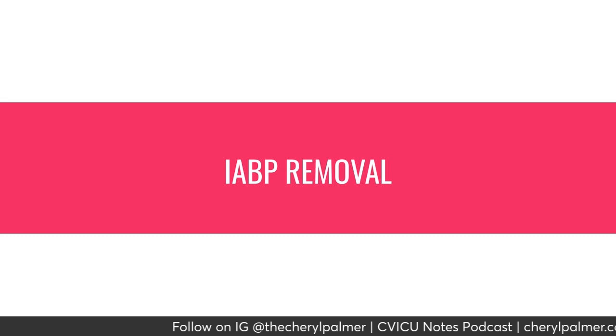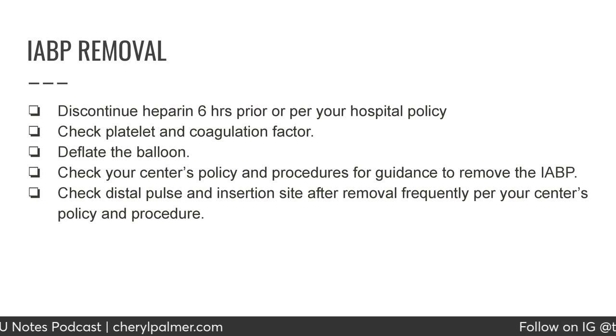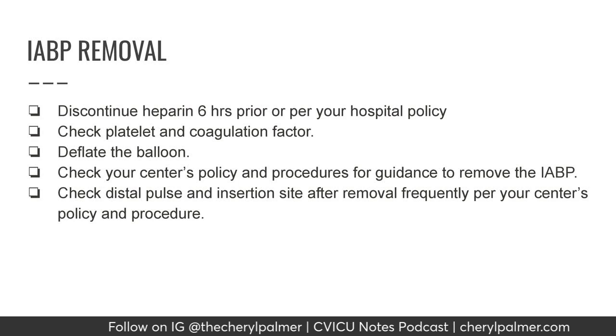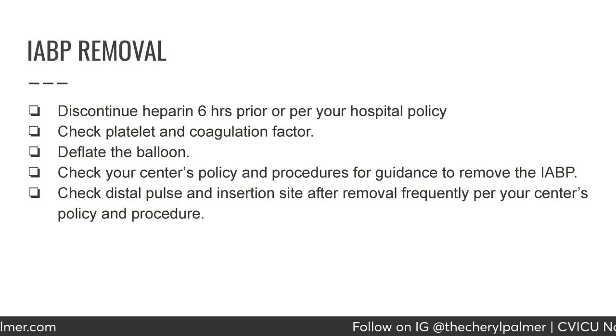Balloon pump removal. Discontinue heparin 6 hours before the removal or per your hospital policy. Check your platelet and coagulation factors. Deflate the balloon. Check your hospital's policy and procedures for guidance to remove the balloon pump. Check the distal pulse and insertion site frequently after removal, per your hospital's policy and procedure.